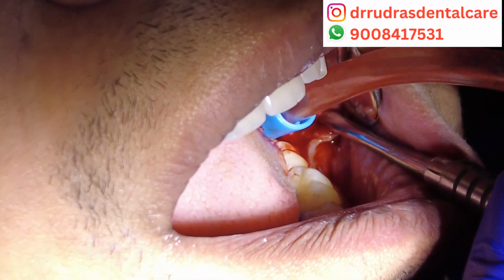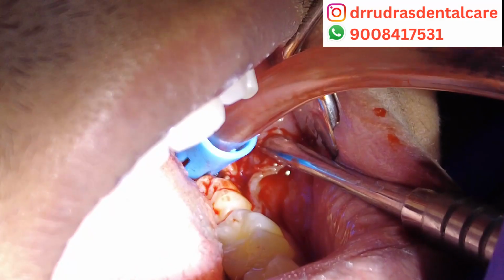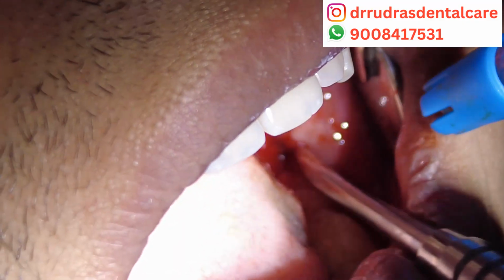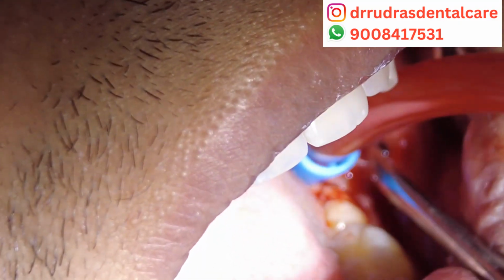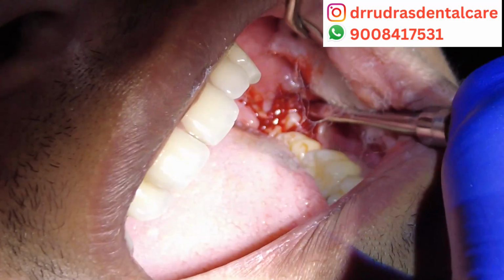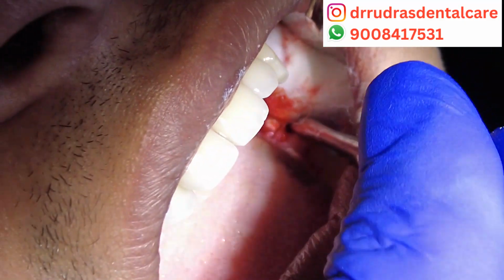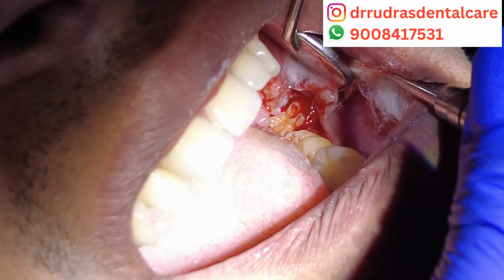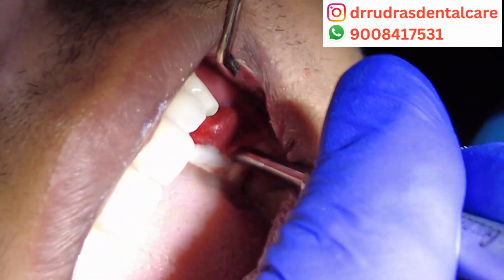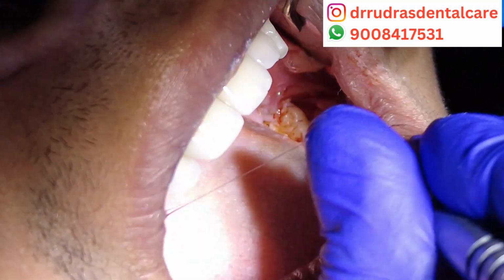If you can appreciate, you can see the impacted tooth along with some food debris that was present there. Now we are using the periosteal elevator to start to luxate the tooth so that we can take it out. We were definitely wary of the fact that it might have to go for a surgical extraction, but we always try to go for a non-surgical extraction approach by using the wedge principles and the lever principles. And here we are trying to luxate the tooth out. You can see the tooth is there.